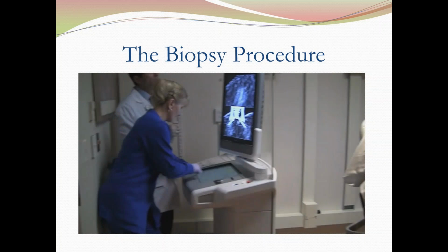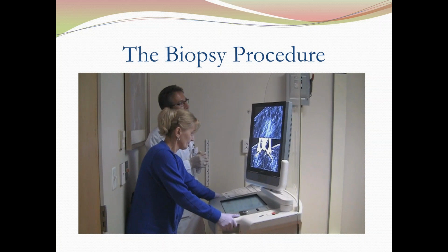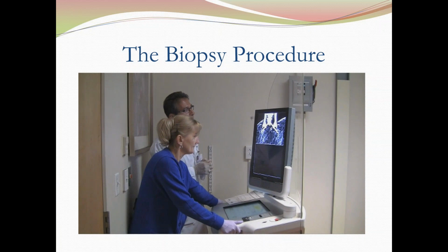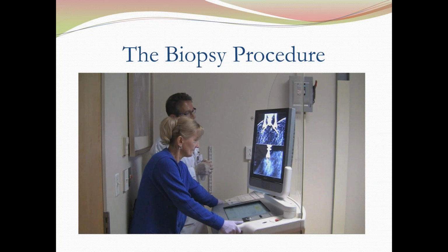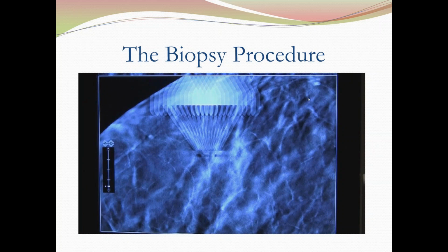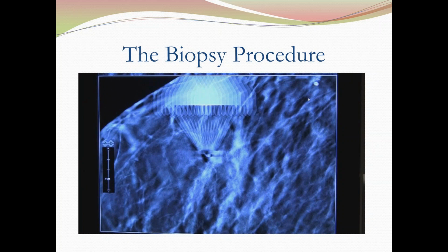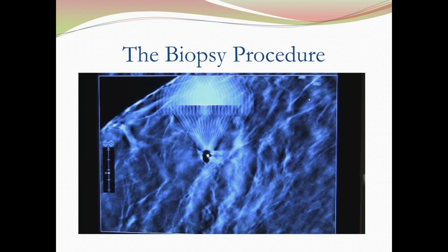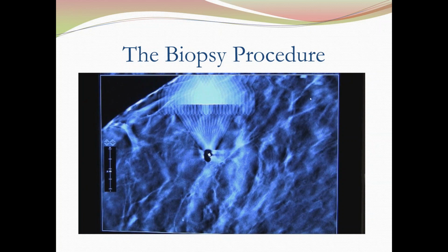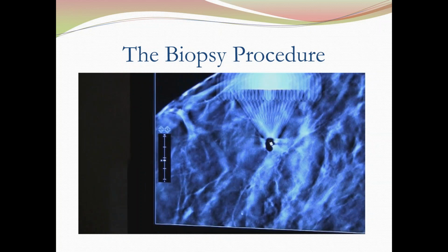And then I'm going to do a tomosynthesis. And I'm going to make sure that the clip deployed. And now I can scroll through the lead, and I can see my clip, and I can actually see the Z. I can compare the Z of my clip to the Z of my target.